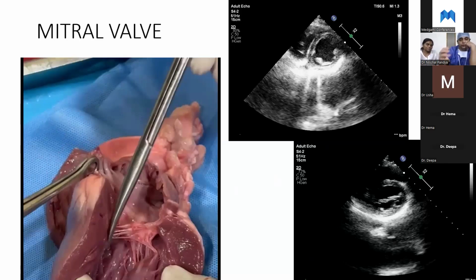It is important to know how big that LA actually is for TAPVCs, and especially our supracardiac TAPVCs, because the cut would go into the LA appendage, unlike an infracardiac where it would come onto the body more or so. So those are the little implications for us.